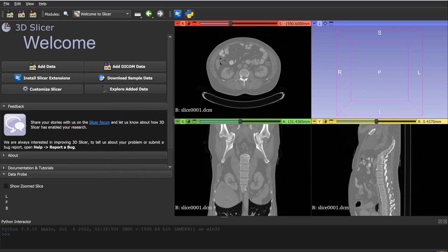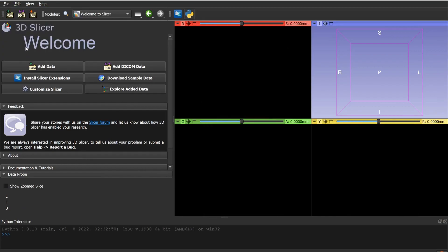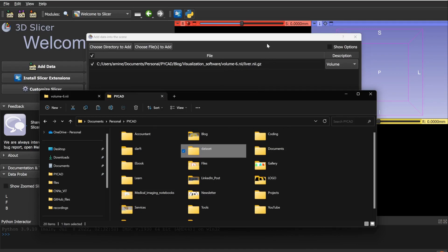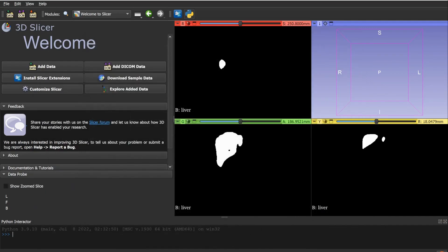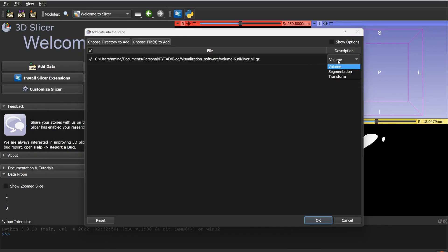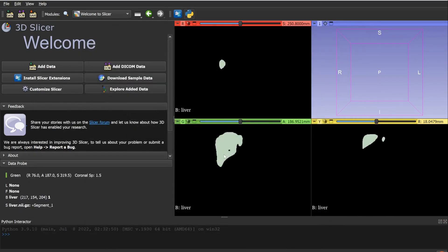Now I'll show how to convert a segmentation file — such as a NIfTI or NRRD segmentation — into an STL 3D mesh, which is commonly needed for 3D printing. Open the segmentation file (in this case a liver segmentation) by dragging and dropping it, then select it as Segmentation rather than Volume. You should now see the green mask displayed, which is the segmentation.